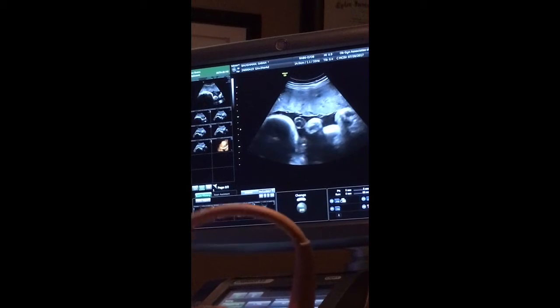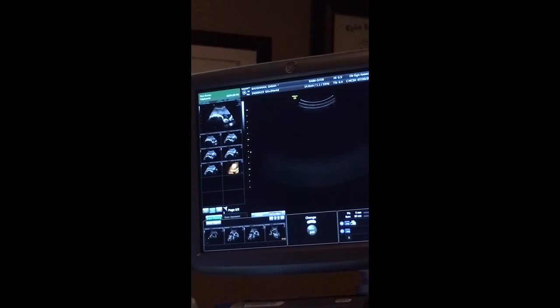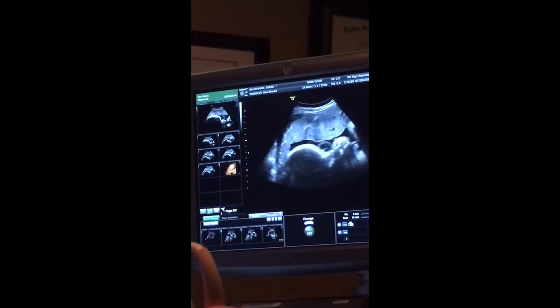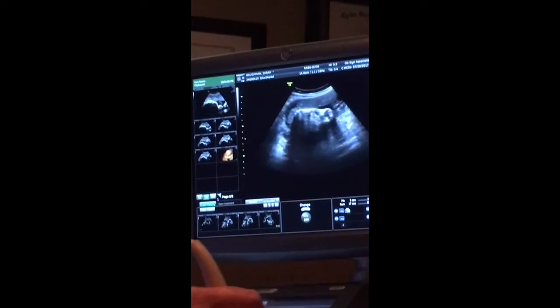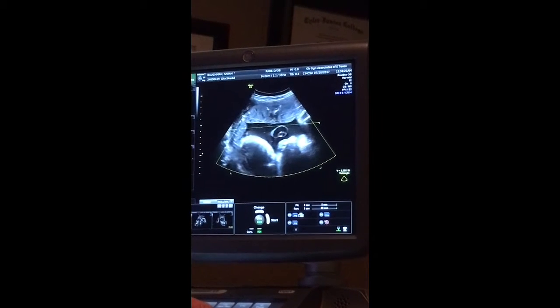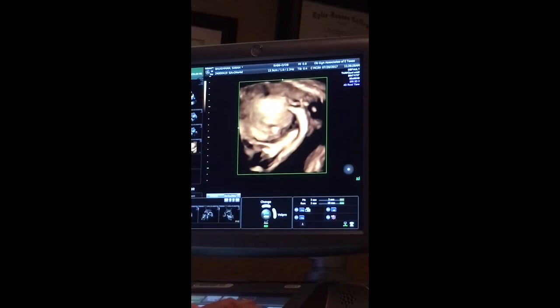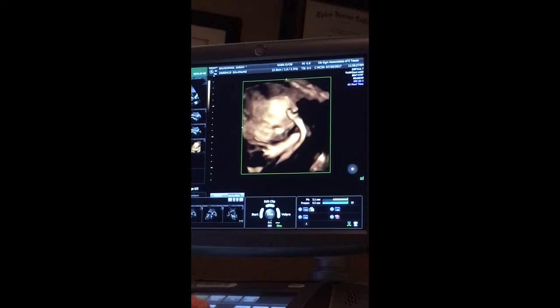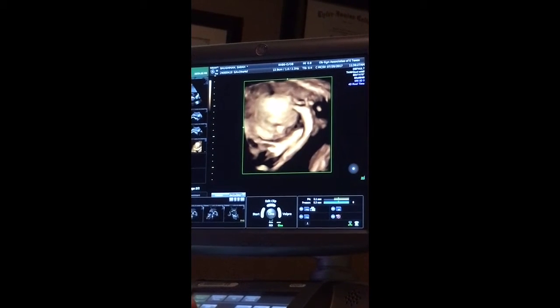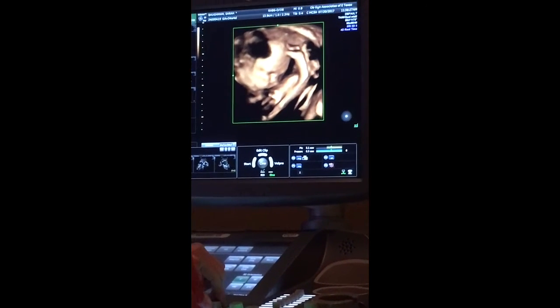She's got a lot around her, so she's automatically one of those. Turn towards me, Sarah. Your side. There you go. See those legs stretched right up her face. I think that helped a little bit though. Look, you can see a little bit of her there. A little bit of her little nose. That's her leg coming up. Jeez. Flexible. Oh, yeah, she is. They're very flexible at this stage.